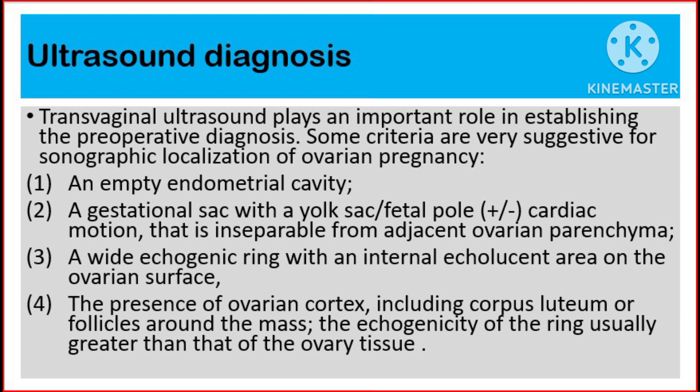Number 1: An empty endometrial cavity. Number 2: A gestational sac with a yolk sac or fetal pole with or without cardiac motion that is inseparable from adjacent ovarian parenchyma. Number 3: A wide echogenic ring with an internal echolucent area on the ovarian surface.